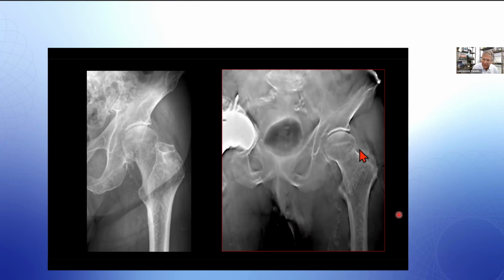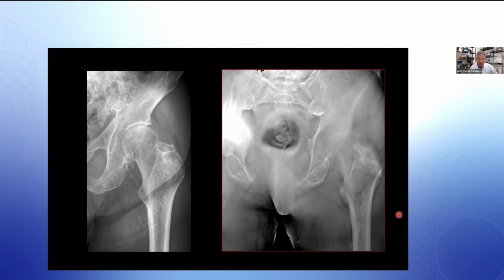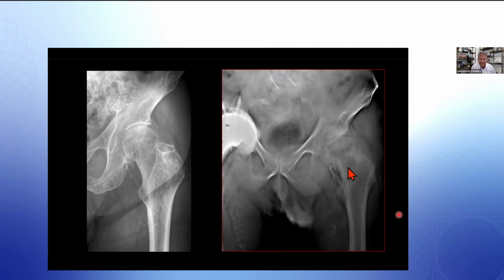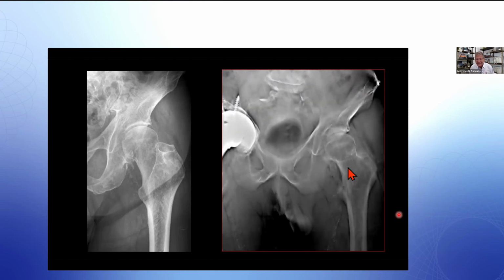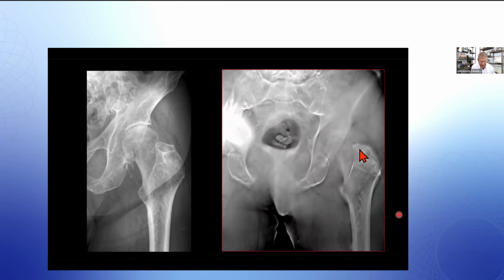And I think one of the themes I'm going to hopefully impress on you today is that patients in your office, okay, you can give an incomplete answer, get something else, get a CT scan, come back in a week, or you can go that one step further with tomosynthesis and be definitive. Get it right the first time. Be patient focused and not make the patient come back for an answer.